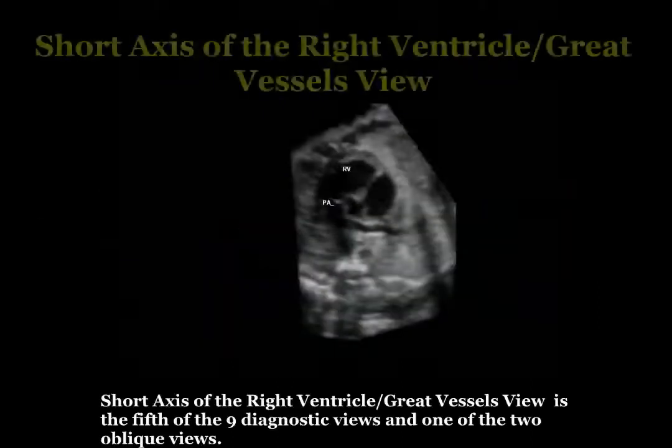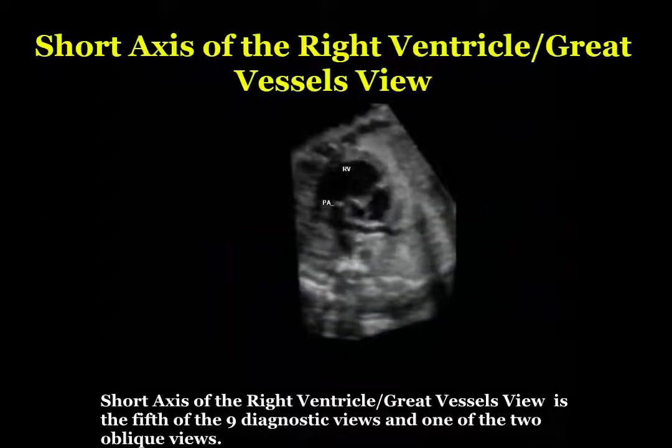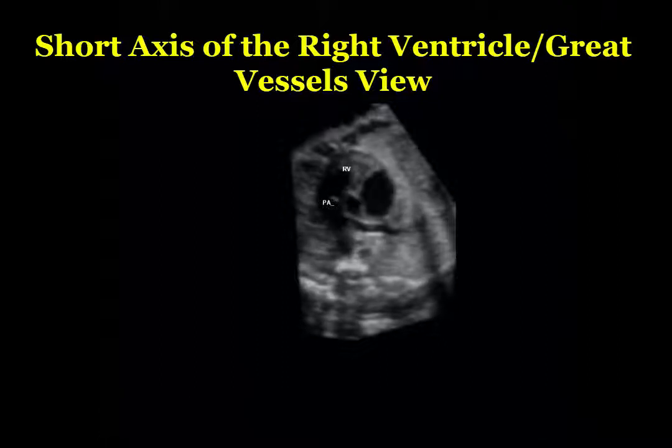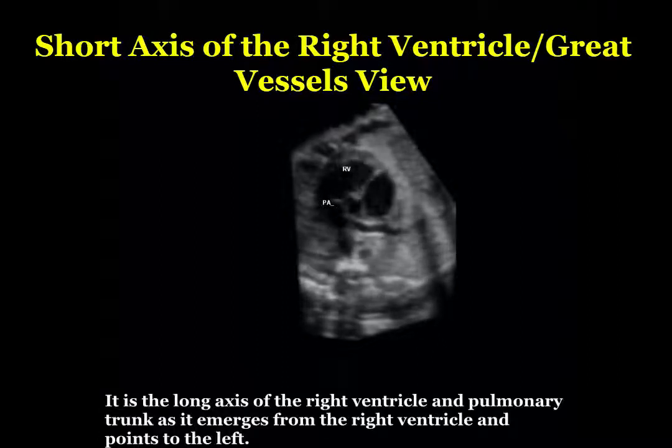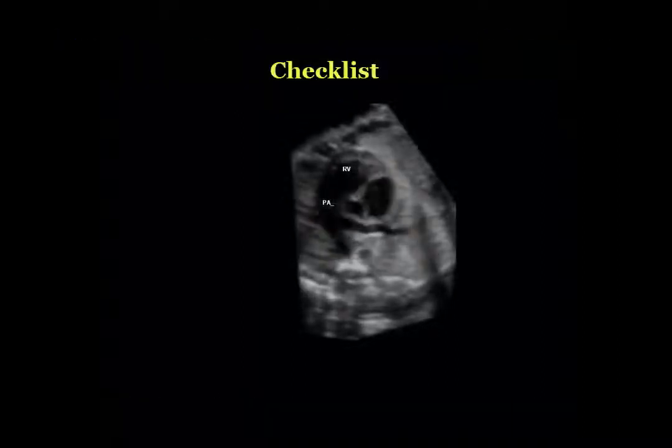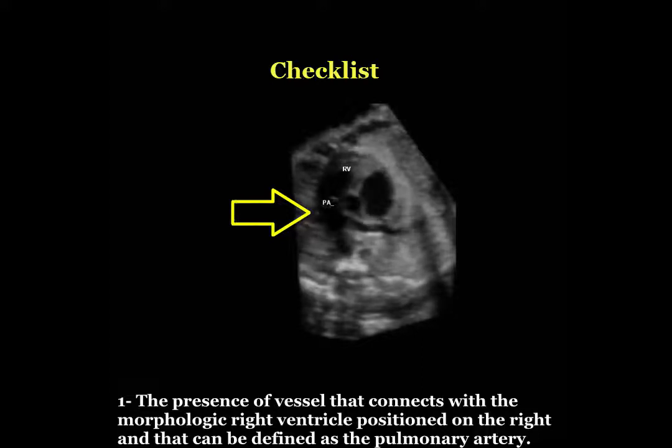Short axis of the right ventricle and great vessels view. Short axis of the right ventricle and great vessels view is the fifth of the 9 diagnostic views and one of the 2 oblique views. It is the long axis of the right ventricle and pulmonary trunk as it emerges from the right ventricle and points to the left. Checklist.